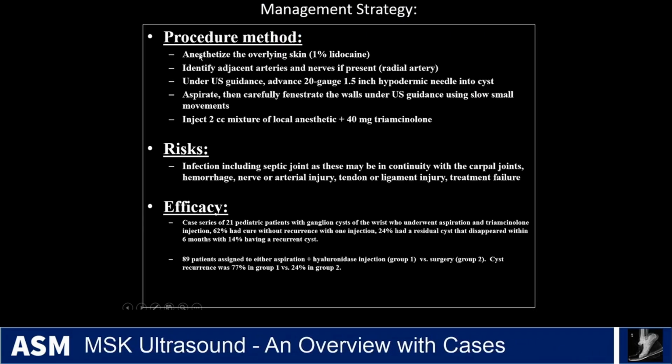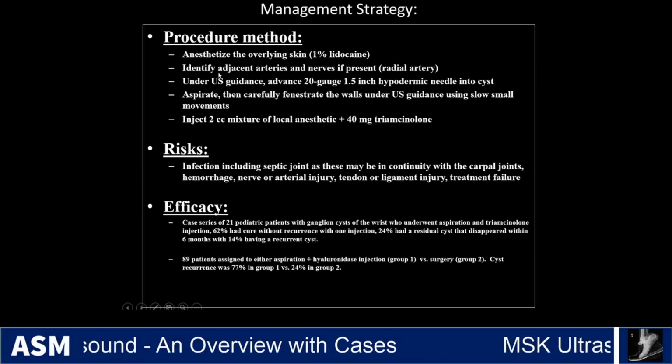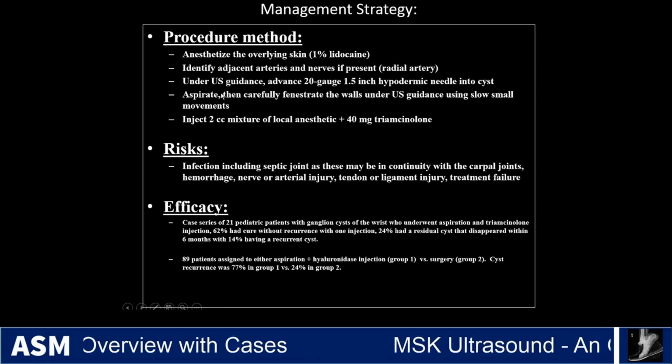So what would be done? You would again anesthetize the skin, clean it up, sterile probe cover, etc., and then using ultrasound guidance, use a small needle and go into the cyst and try to aspirate it.